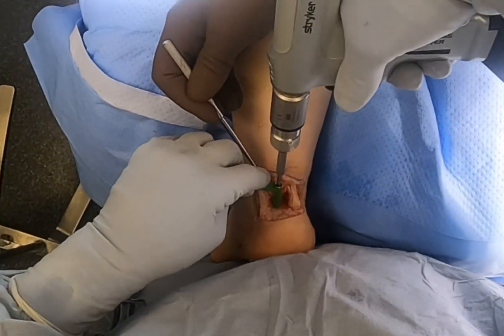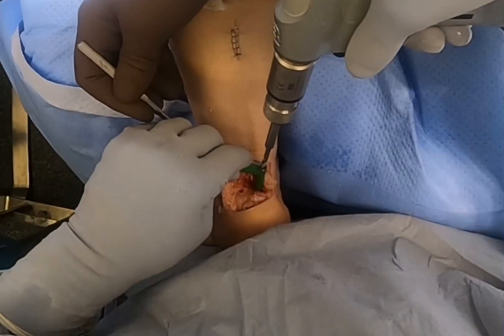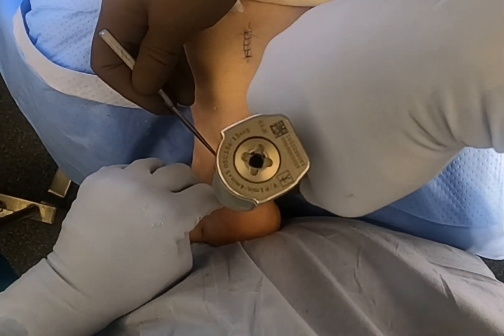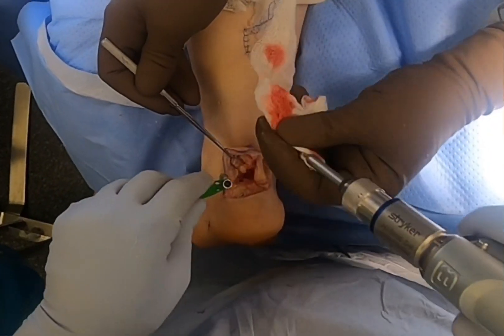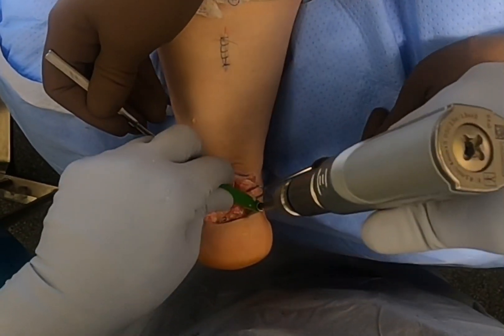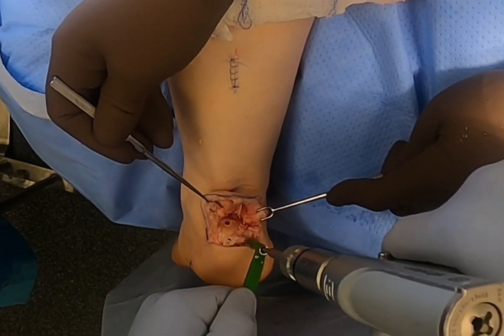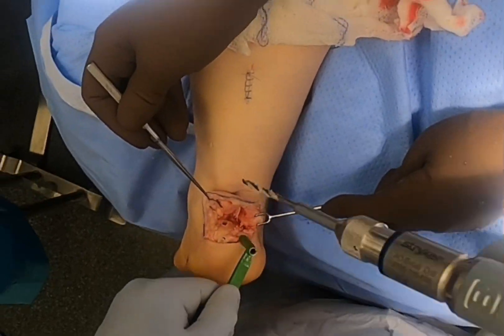Once I have the spur off and the Haglund's deformity off, I use a reciprocating or power rasp and smooth this area completely to a rounded posterior and superior heel. Then it's time to drill the holes for the anchors. The Speed Bridge Knotless Anchor System requires four holes — two superior and two inferior. Here I am drilling the holes with the tissue protector, and once those are drilled, you tap those holes so that the threads catch in the drill hole on the anchor.